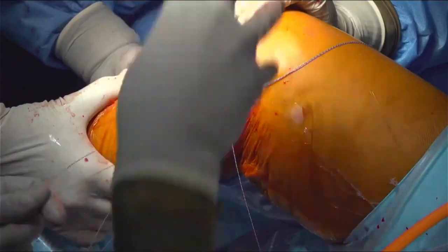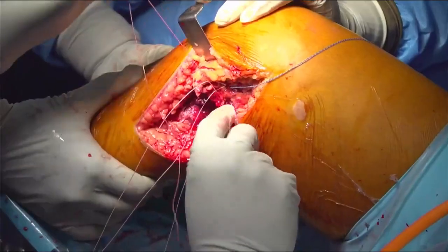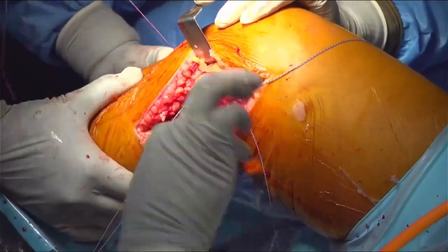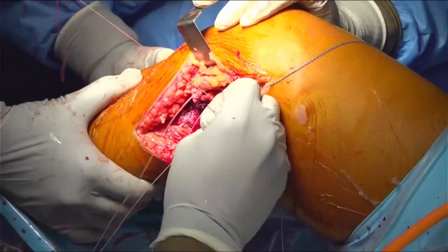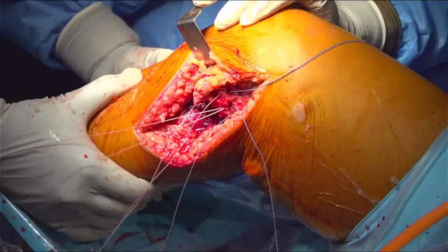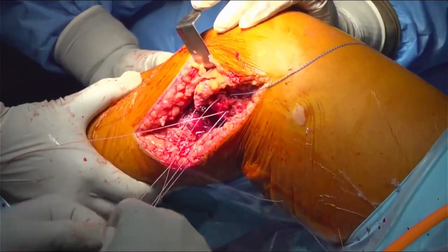So these are my posterior sutures. LR anchor please, inserter please.